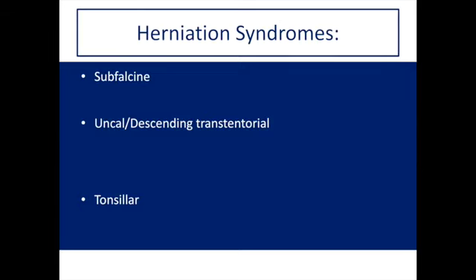The next step, mainly if you're going to go into radiology, is to know the complications of these herniation syndromes, which you should specifically look for. I'll list them here quickly, but won't belabor the point. If you're going into radiology, you need to know these cold, so learn them. The Rad Primer/StatDX article is a good reference. It's actually not that difficult to remember these complications if you learn the anatomy.